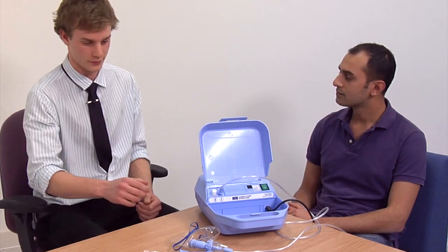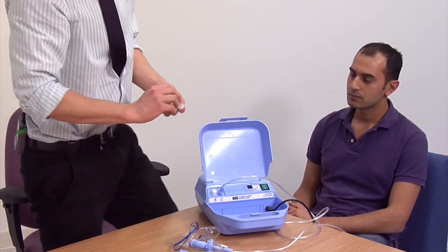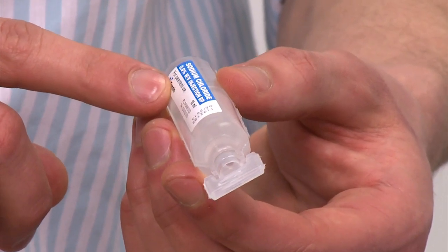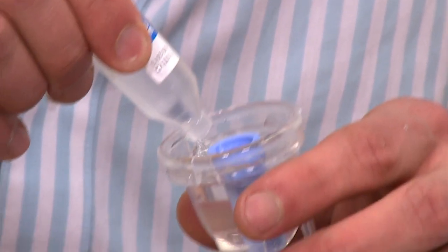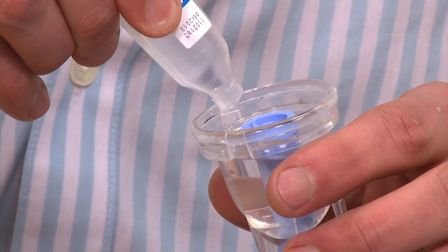Check the label and expiry date of the saline to be used. Then open the nebuliser chamber and deposit the saline. Drugs, such as salbutamol, are also added in this way.